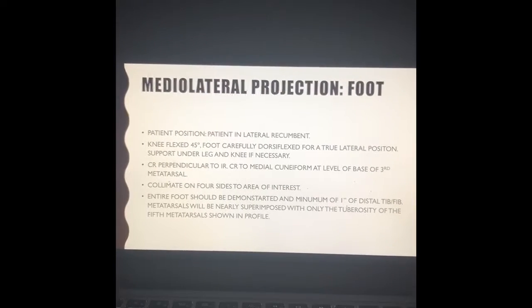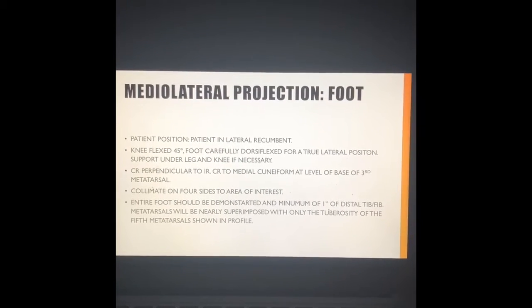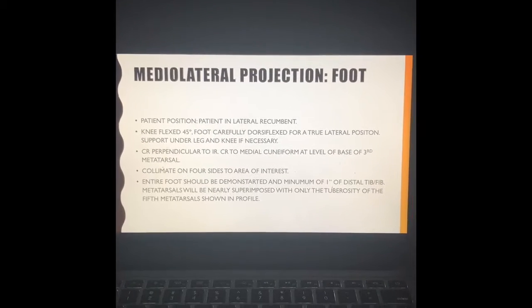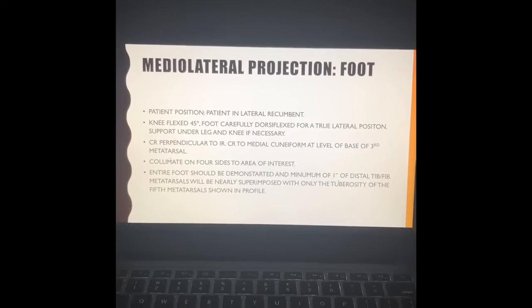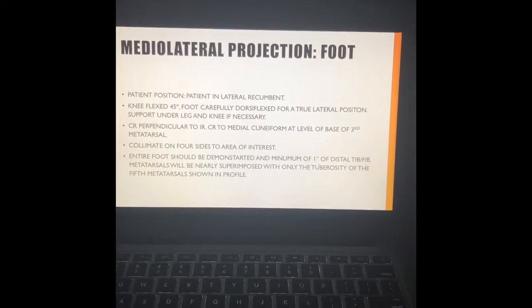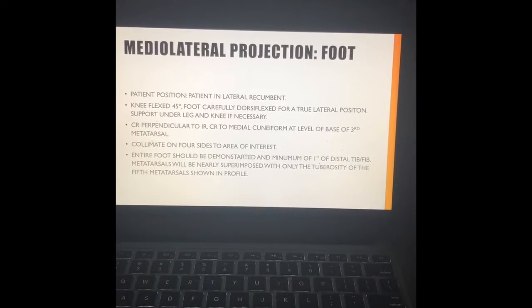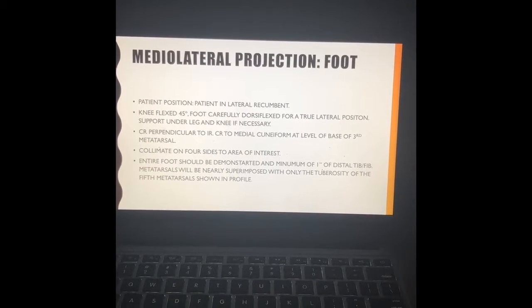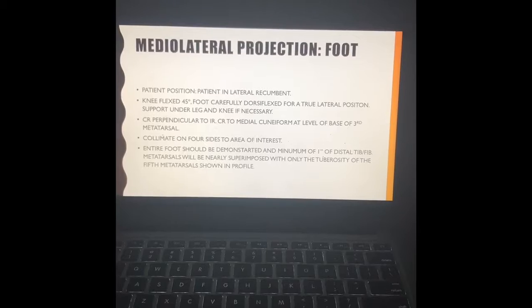Patient position of the medial lateral projection of the foot. Patient is in lateral recumbent. Knee is flexed 45 degrees. Foot is carefully dorsiflexed for a true lateral position. Support under leg and knee if necessary.